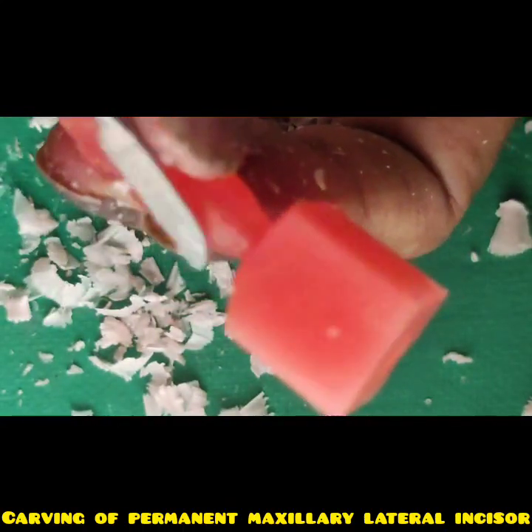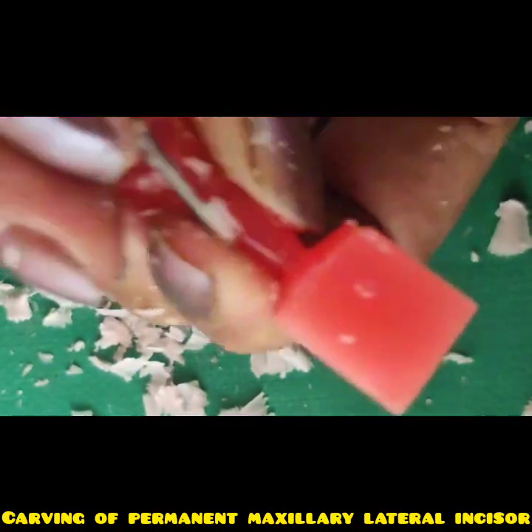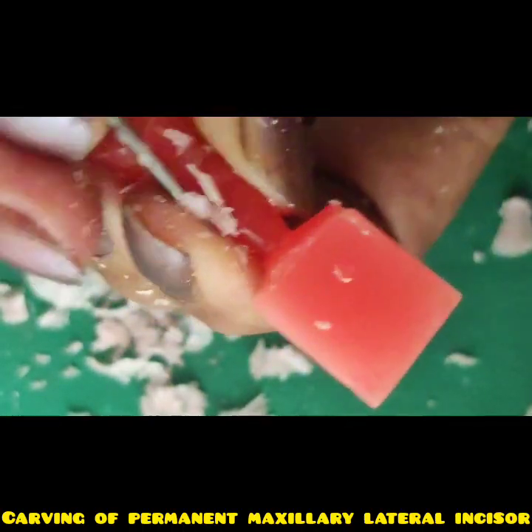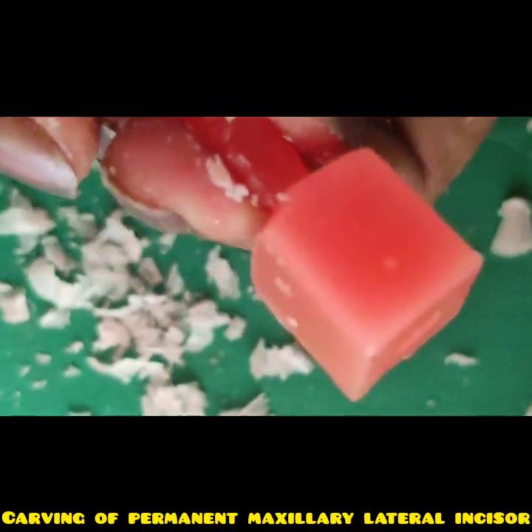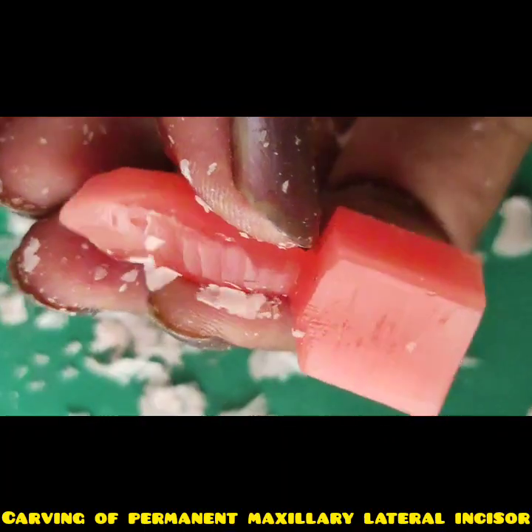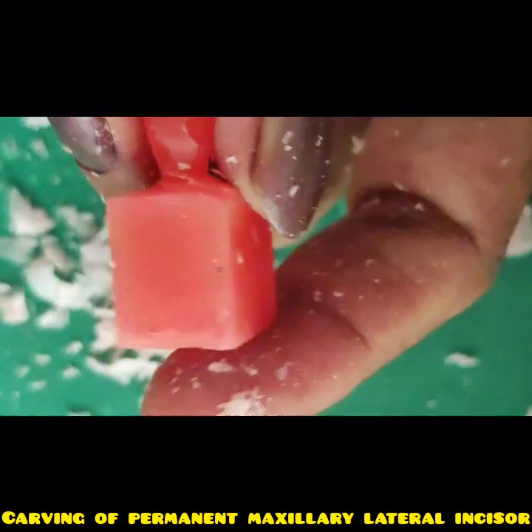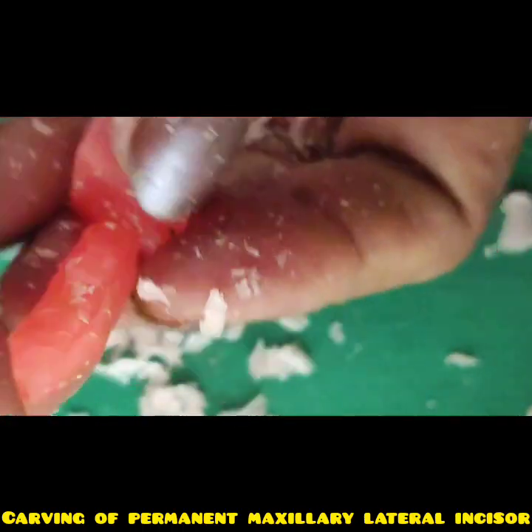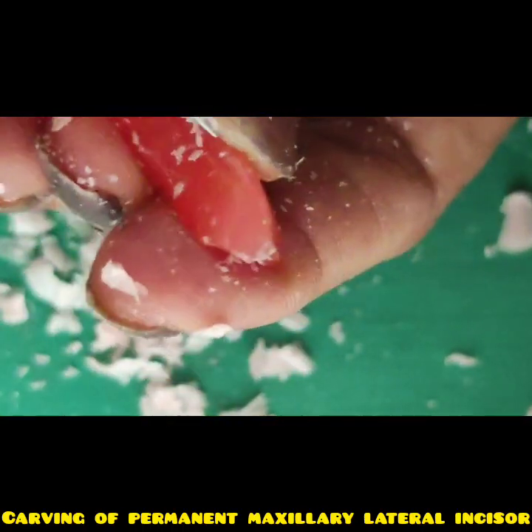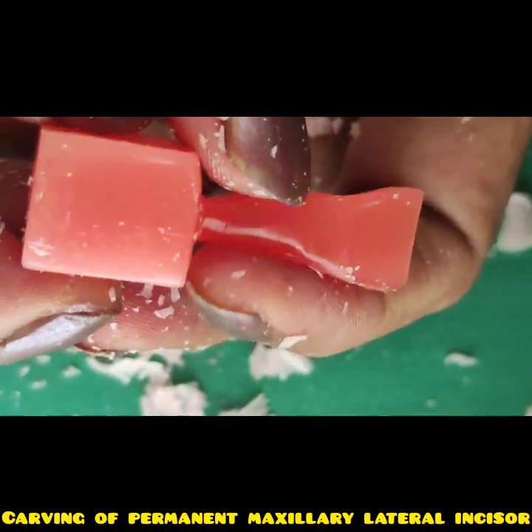Now you can see the root is a little plump on this side. Reduce the root bulk, like how I said, the root should be parallel for the upper two-thirds outline. Like this, it should be parallel in outline, then smooth tapering, and it should be roughly triangular in shape in cross section. Like this. So this bulk I will reduce.